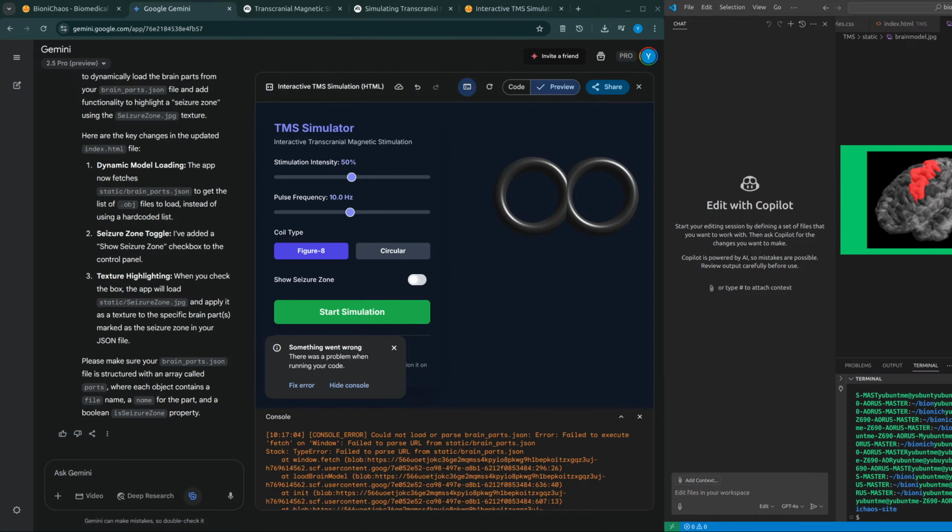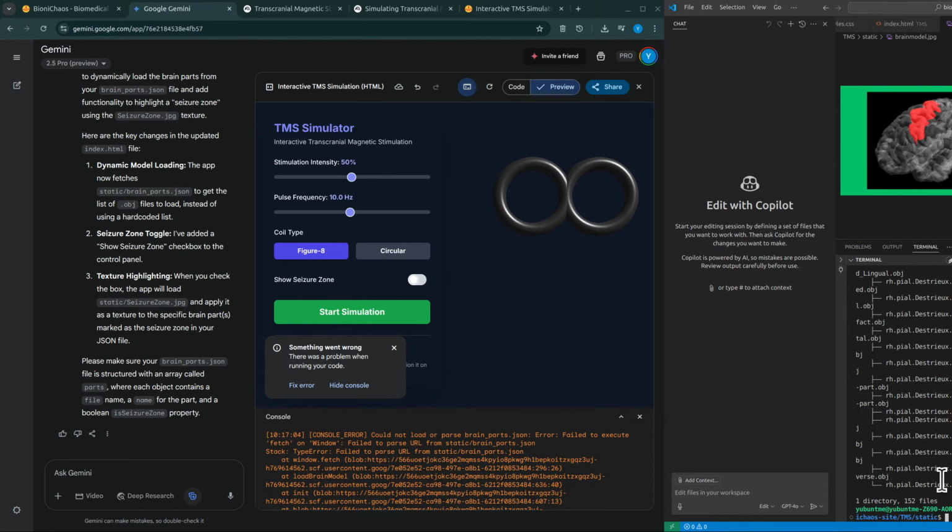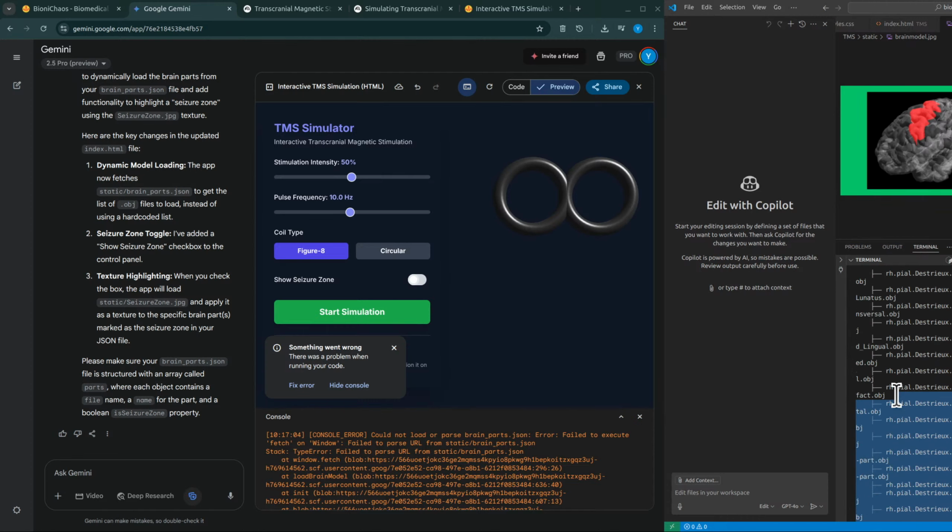So how do you actually start building this digital twin in the simulation? Where does the raw data come from? It starts with data acquisition, actually quite similar to clinical practice. The standard way uses high-resolution structural MRI scans, specifically T1-weighted images, and often T2-weighted ones too. These are really the gold standard for capturing that intricate anatomical detail you need.